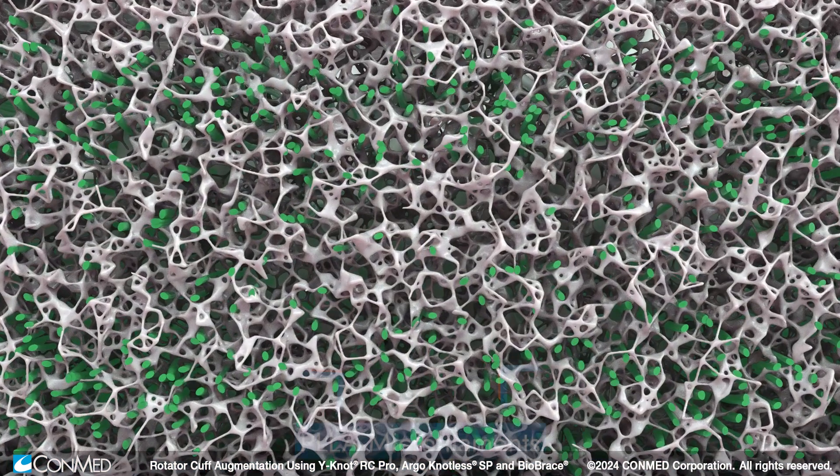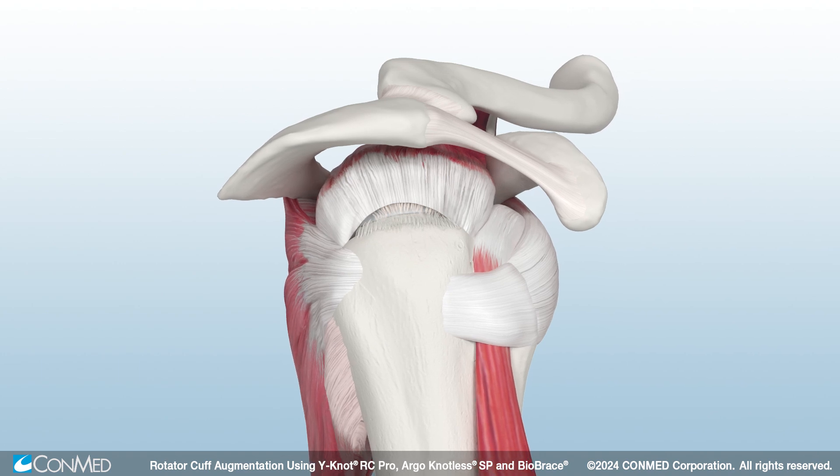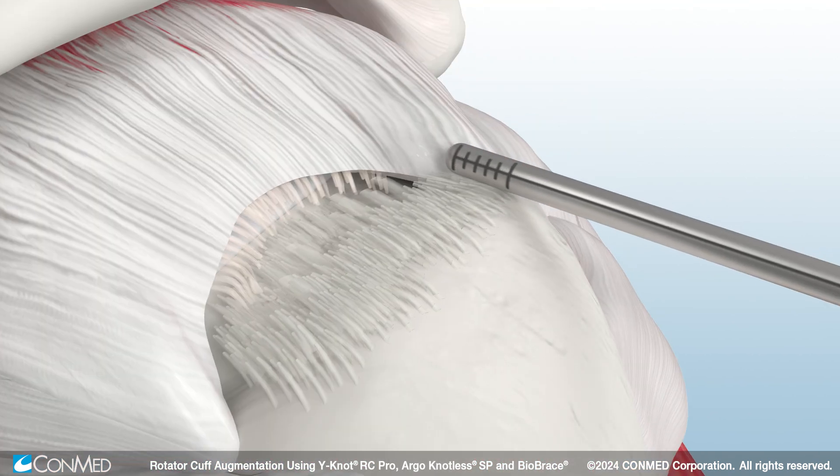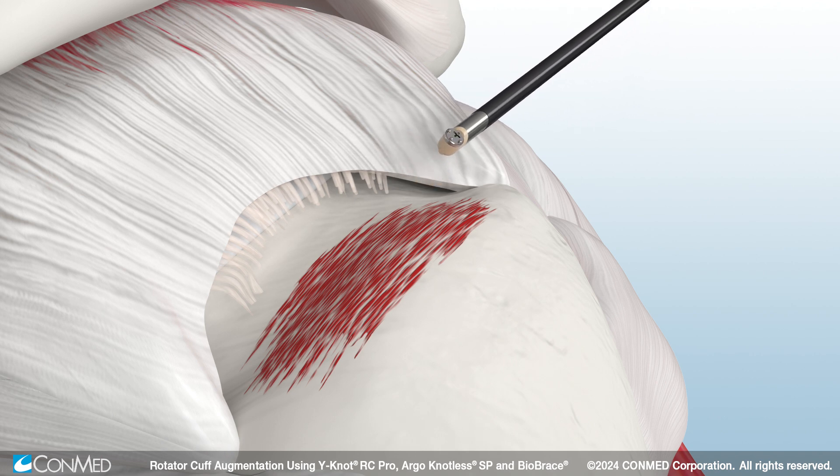The three-dimensional scaffold reinforces the repair while facilitating cellular ingrowth through the open architecture. To begin, prepare the footprint and subacromial space using ConMed's Stealth Shaver Blade and the Edge Bipolar Arthroscopic RF device.